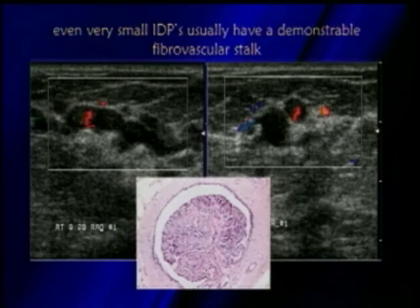Color Doppler can also be very helpful to evaluate a fibrovascular stalk. Papillomas tend to have quite a bit of flow within them, and typically a normal single vessel feeding them. So here is a short axis view where we can see this fibrovascular stalk feeding the papilloma. If you notice, there is some ductal ectasia here, but this is just some thick secretions. There was no flow located in that area on that particular patient.